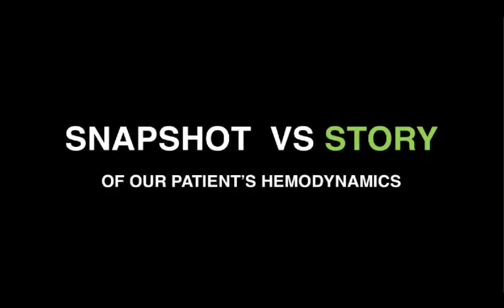And what we can do with echo in our critically ill patients is to tell a story that will help us better understand what's going on throughout the stay of our patient, and even more, a story that can be helpful for those taking care of our patient in the next 12 hours or days coming upstairs. So not just a snapshot, a one-time assessment, but an actual minute-to-minute or hour-to-hour assessment of the patient's hemodynamics.